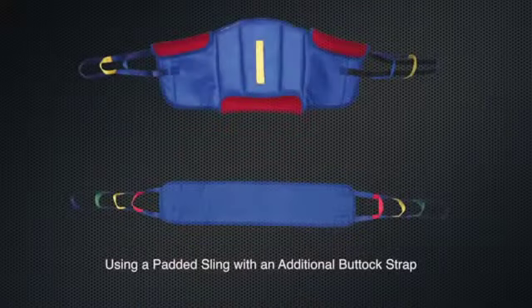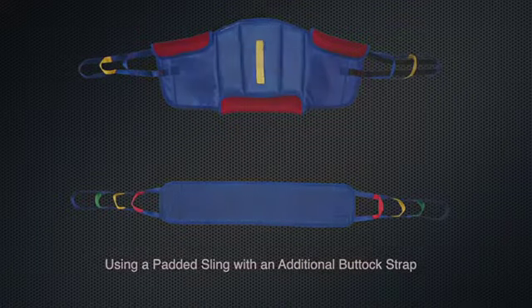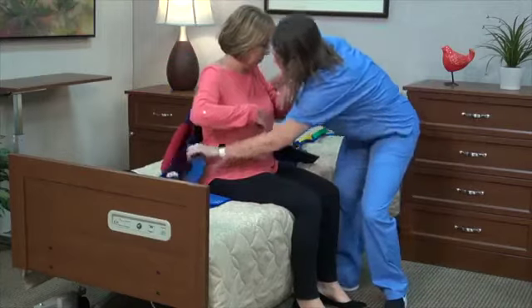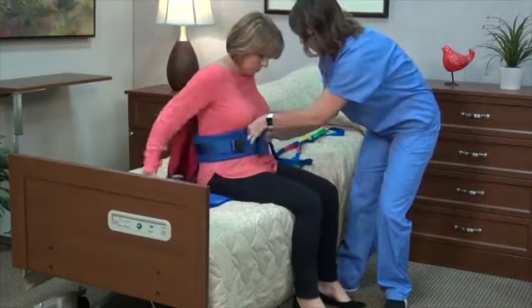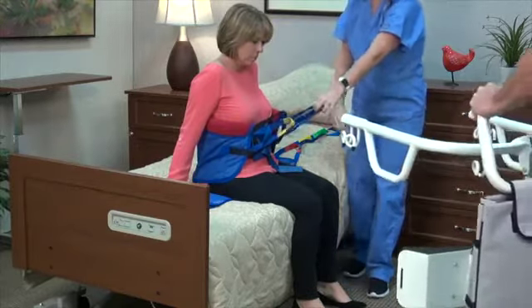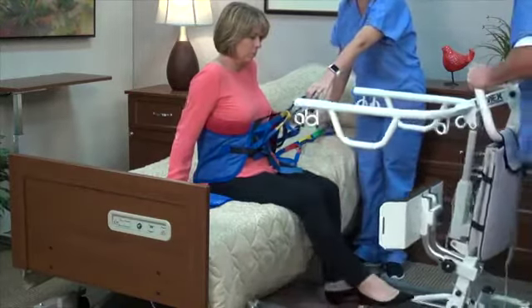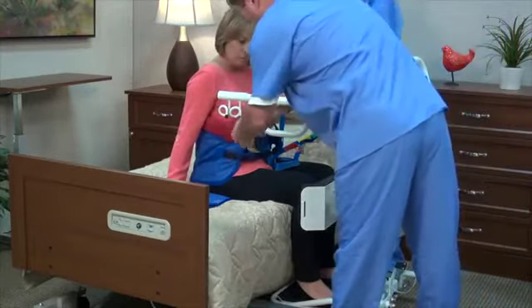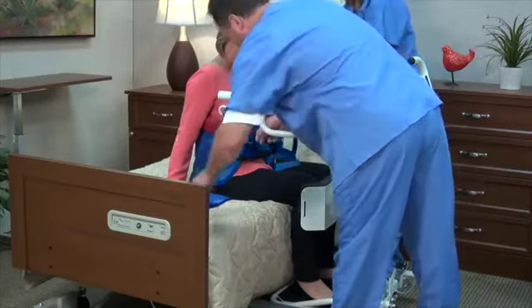Using a padded sling with an additional buttock strap: some residents feel more secure with the use of a buttock strap. Slide the strap under the legs midway under the thighs. Attach the deluxe sit-to-stand padded sling to the outside hooks and the buttock strap to the inside or front hooks on the lift.